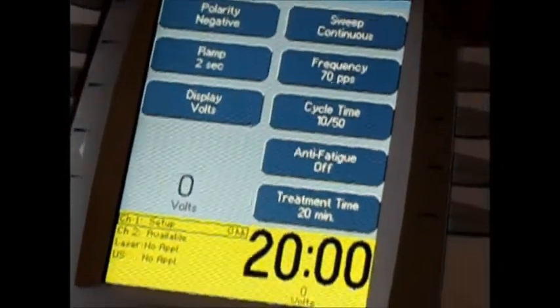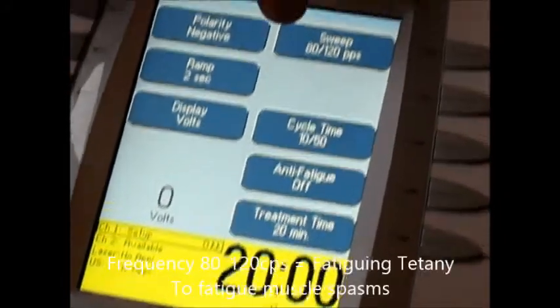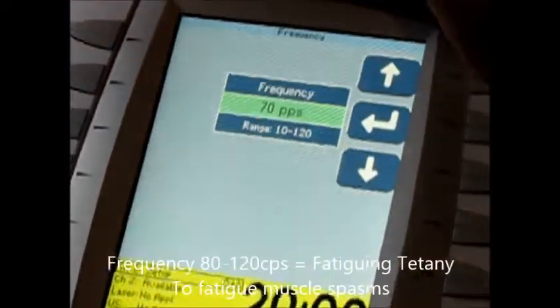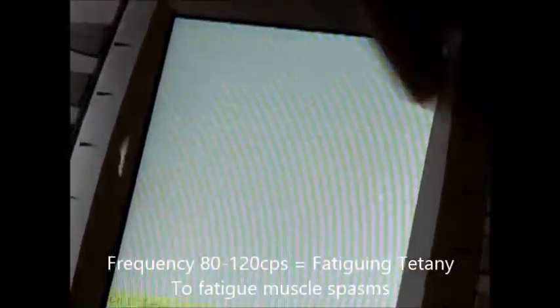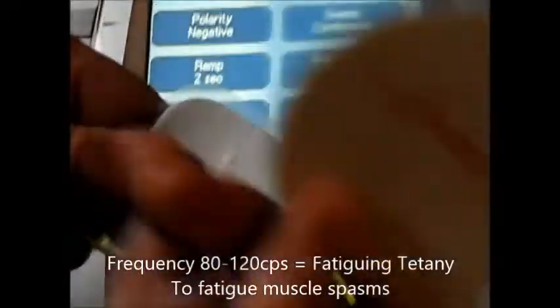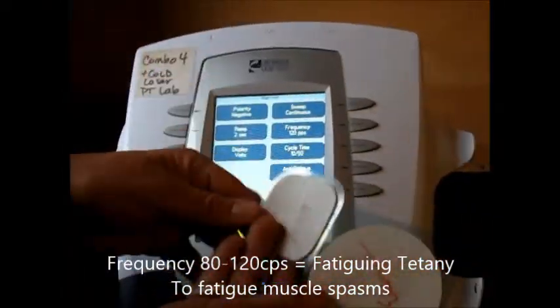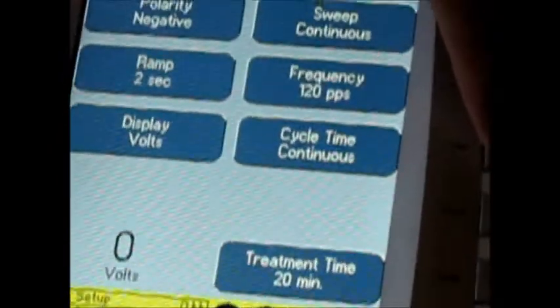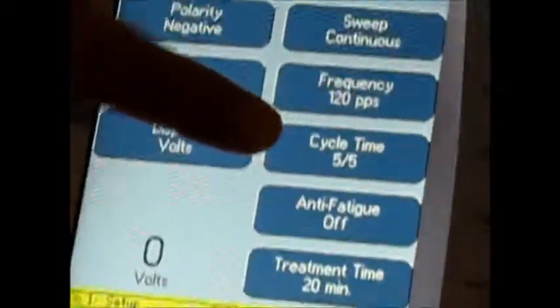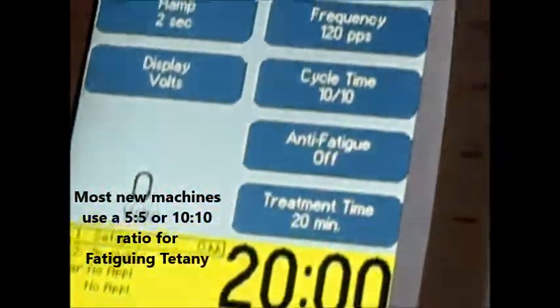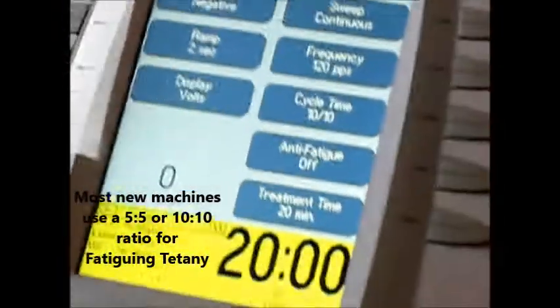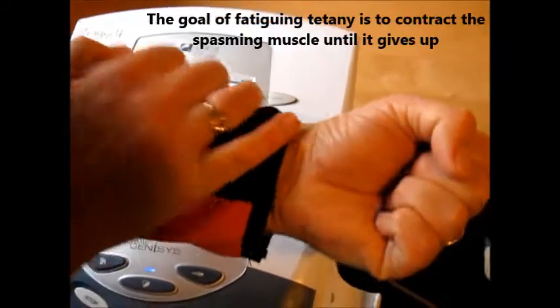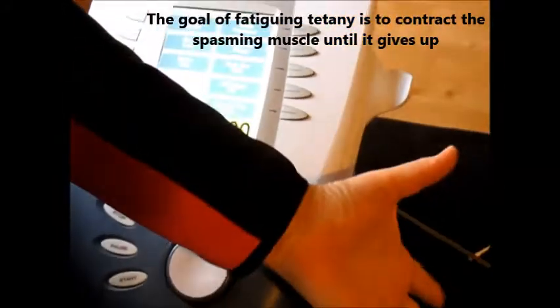Now let me talk about the last frequency setting — it's called fatiguing tetany. Fatiguing tetany is anywhere from 80 to 120 cycles per second. I like to bring it up to 120, which is its max. I'll put this on the trap that has a spasm and this on the low back or the thigh. I need to change my cycle time. Ideally it would be 50 on and 10 off; however, that's pretty hard on people. Most machines now say five-to-five or 10-to-10. With 10-to-10, you're on for 10, rest for 10, and get back in really fast — contracting the muscle repeatedly until the muscle gives out and the spasm releases.